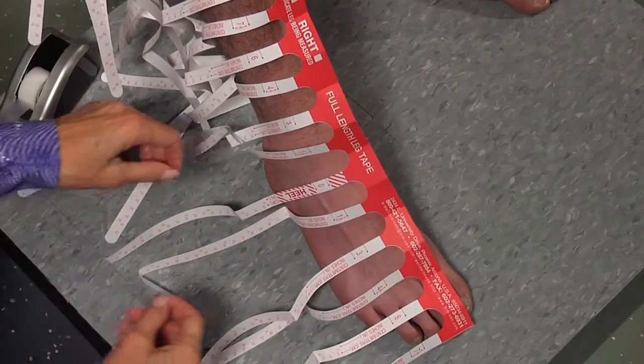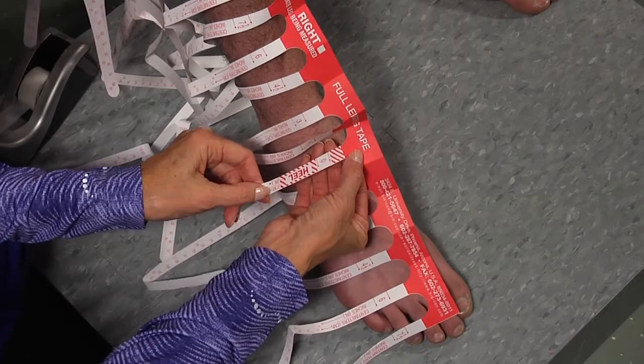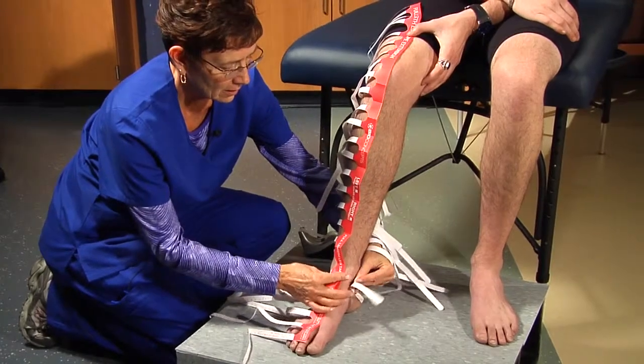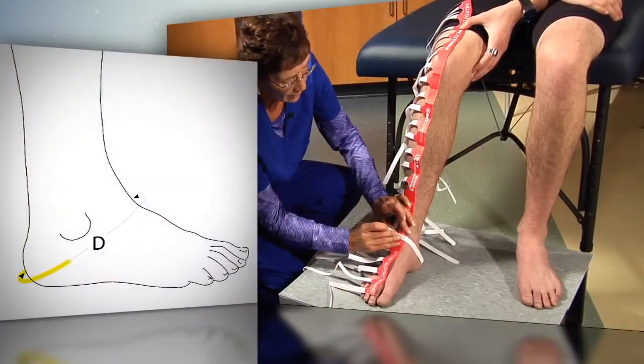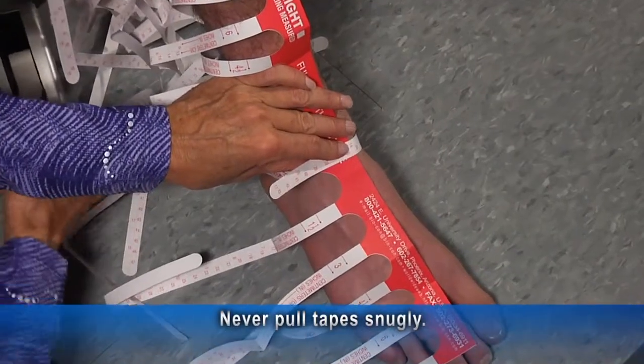It is essential when measuring with paper tape that you locate the heel first. The heel strap has to be attached first in order to anchor the tape. Secure the tape around the ankle to the back of the heel. This is circumference measurement, capital D. Remember, never pull the straps snugly.